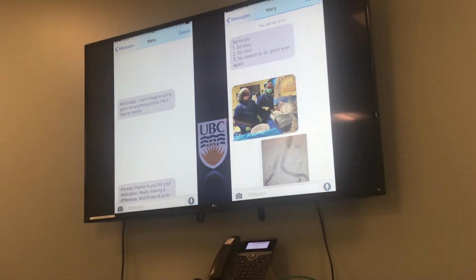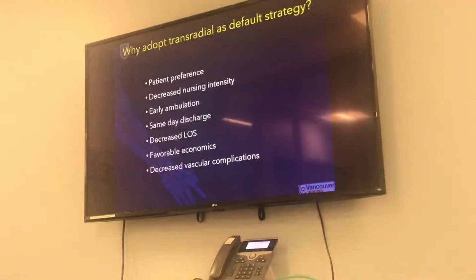And I travel the world teaching doctors how to do radial intervention, a lot for fibroids. This is a friend of mine who I taught many years ago to do radial intervention. She didn't do it for 3 or 4 years, and then she came to another talk I did when there was a conference here in Vancouver, and then she went back and changed her practice, and she hasn't looked back. I think that's what happens with a lot of operators. First, when they think about doing it through the wrist, it seems like a long way to get to the pelvis, but actually in reality it's a lot easier and a lot faster.